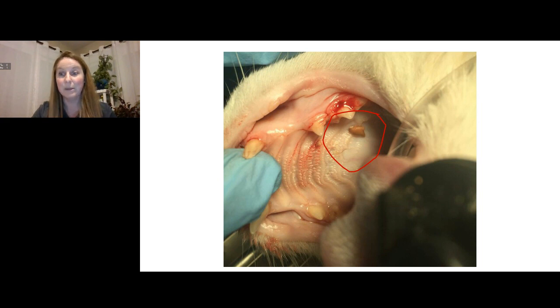And the reason that I put this in here is because when it comes to dental radiographs, it's really, really easy to get really caught up in overinterpreting them. And we want to be super careful and super cautious that we always take a step back and we identify what's going on with our patients' mouths too. When we send out a dental radiograph for interpretation and we don't include clinical images, it's impossible to know exactly what's going on with our patients and the whole story and the whole picture for those recommendations. So just keep in mind that there's more to your patient than just what you're seeing on the radiograph. Maybe take a step back and evaluate the bigger picture too. Don't get too caught up in over interpreting things.